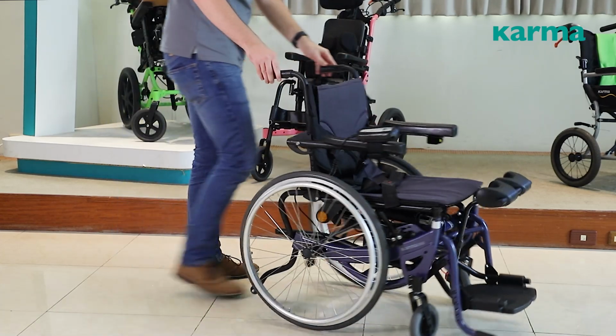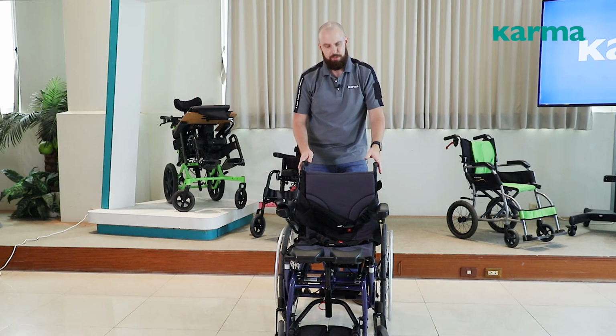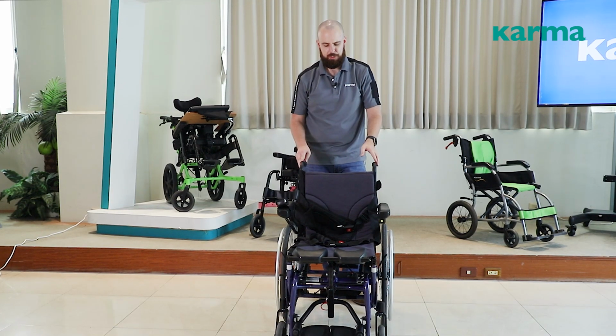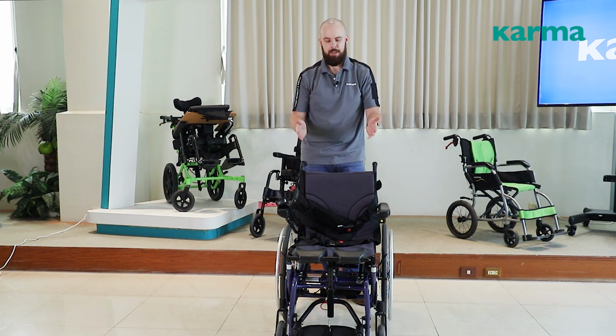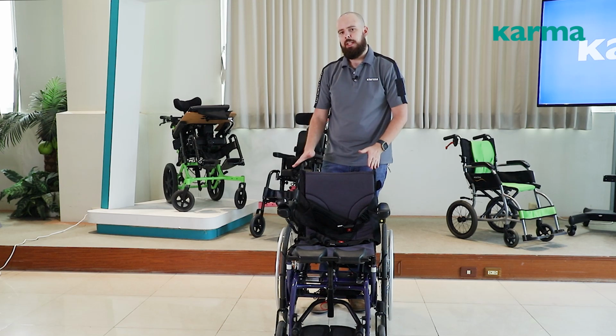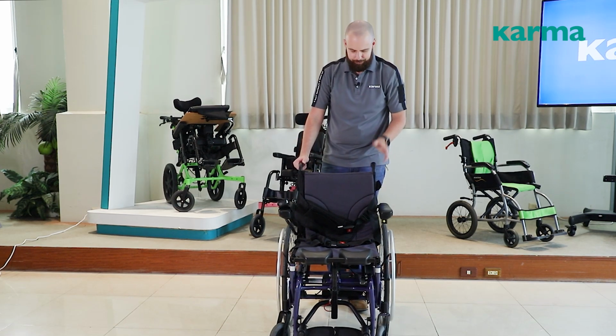That's just about everything for the SME. Just want to mention, total weight of this chair is about 27 to 32 kilograms, depending on the width of the seat you get. So that's about 60 to 70 pounds. And then the weight capacity is 120 kilograms, so about 265 pounds.